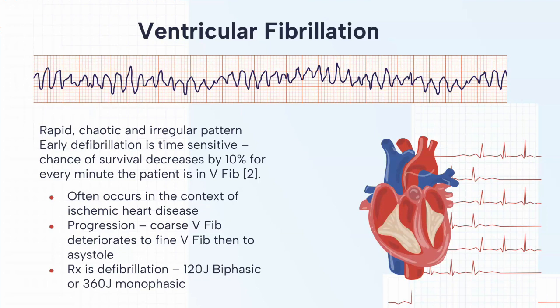And then there are now further studies with people getting older and living longer with cardiomyopathies, ischemic heart disease, and so on. There's a new thing called ventricular storm or VFib storm, where you shock the VFibs and they just don't get out of that rhythm. There's now data suggesting dual sequential defibrillation, where you shock them with pads at the apex and the sternum, and then put a second set of pads at the anterior and posterior of the heart and deliver that shock at the same time using two people if it's safe to do so. Generally, you'll be able to do that if you're using pads and not the paddles on the patient.